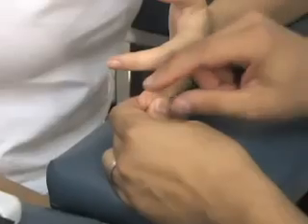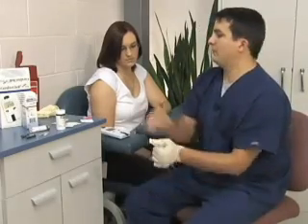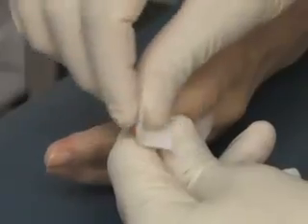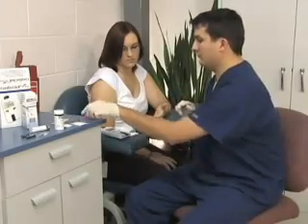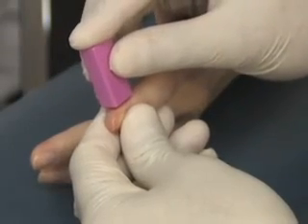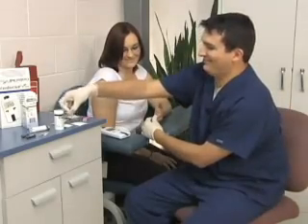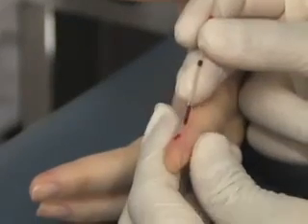Where you want to test from is on the fingertip and just below the nail bed. With your alcohol swab make sure you cleanse the fingertip, and then with your safety lancet place the lancet on the fingertip and gently press down to activate. Wipe away the first drop of blood, take your glass capillary collection device, and collect the remaining drops of blood that come.